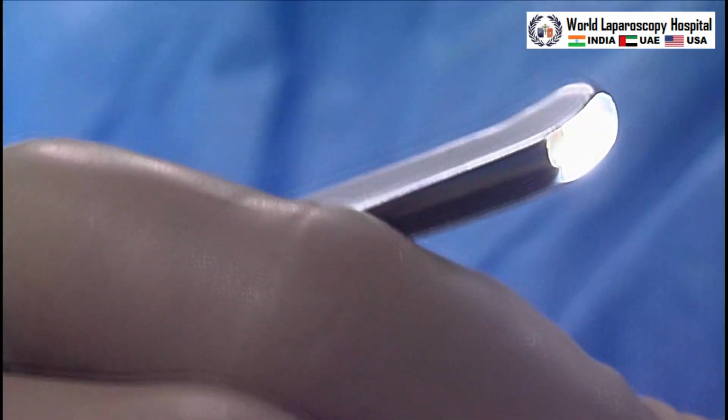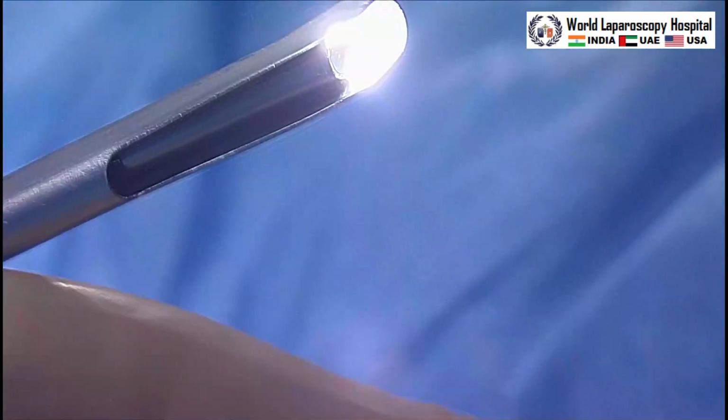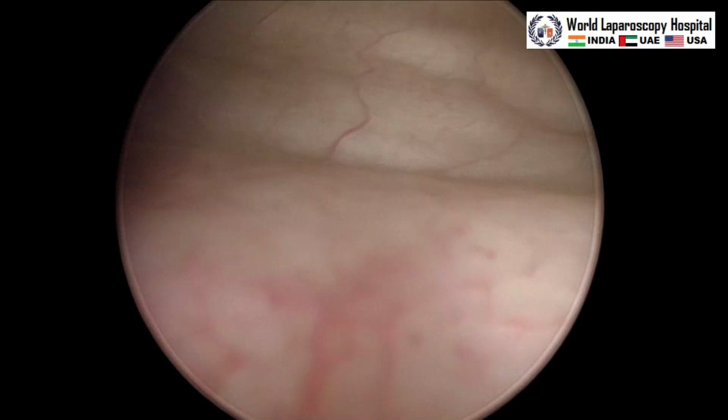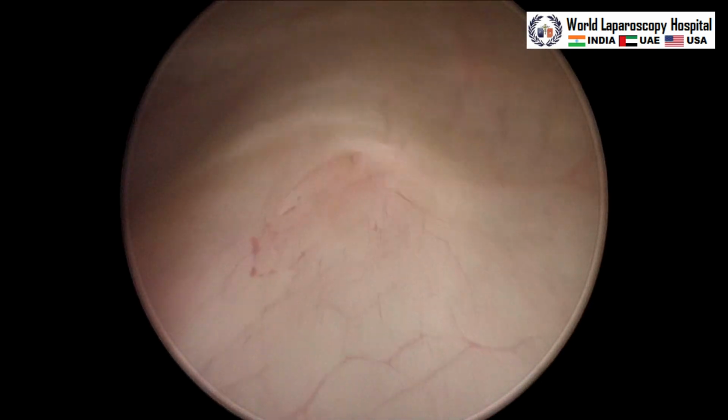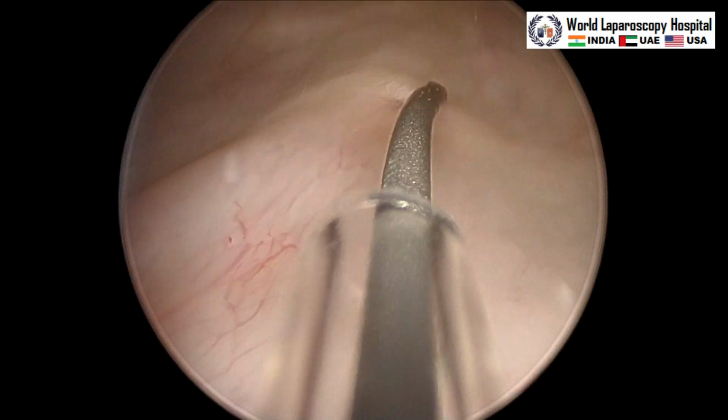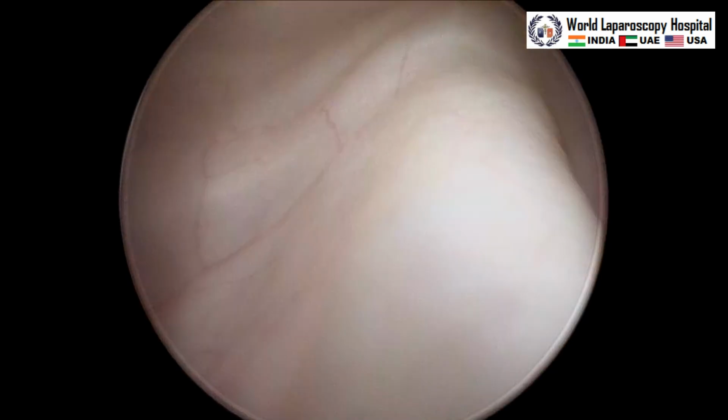catheter. This is the cystoscope with a beautiful blunt tip, and there is a fiber optic 4 mm telescope attached. The cystoscope has a blunt tip that is atraumatic, and this is the ureteric ridge. We can see this is the left ureteric orifice, and this is the soft end of the fiber optic.